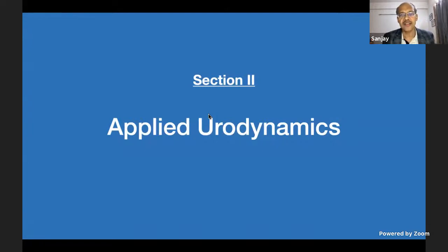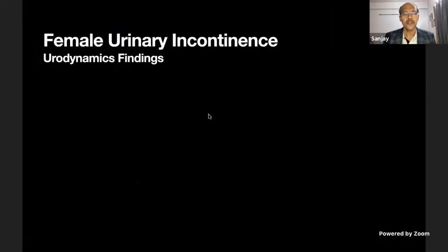And also let's try and answer the question relating to those five clinical conditions I told you about. So first, female urinary incontinence, and what are the possible urodynamic findings? I'm not going into the theory of when to do the urodynamics and so on. But typically you would plan to do an invasive urodynamics only at the point where you are looking at invasive therapies. That's what our guidelines, the USI guidelines, also state.